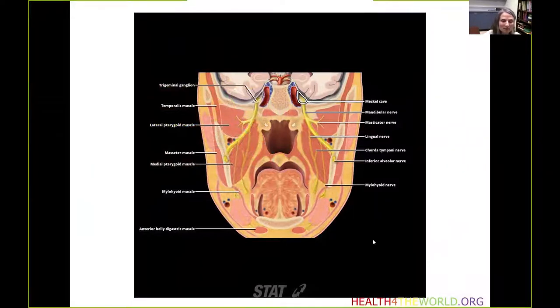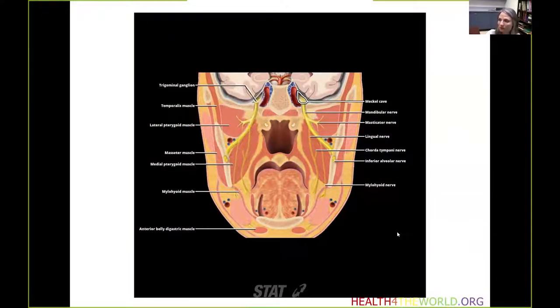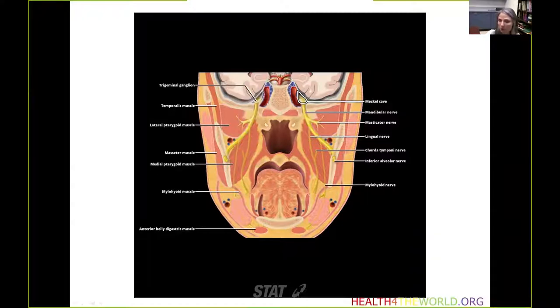This coronal graphic through the masticator space shows the mandibular division of the trigeminal nerve. Note that the trigeminal nerve — the alveolar or mandibular nerve — exits the skull base without entering the cavernous sinus. It exits straight from Meckel's cave and never enters the cavernous sinus.